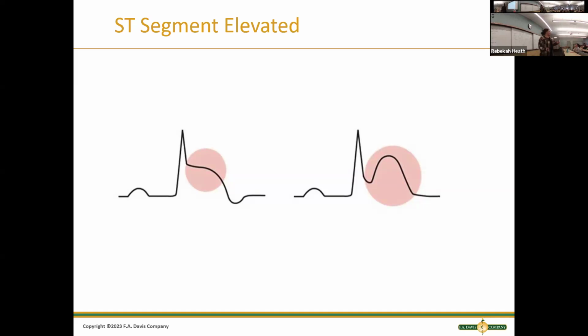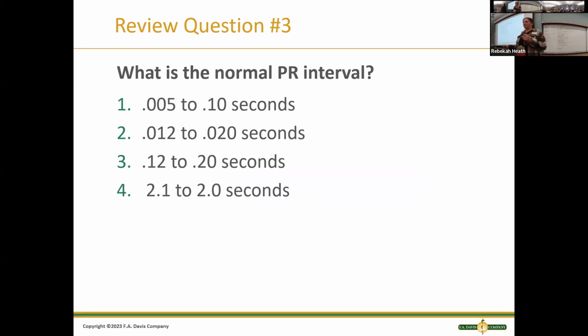So when you think about T waves, if they're big and pronounced, or they're building off of the QRS like that, think bad, tombstone. This patient's probably not doing good. I want to look at that.